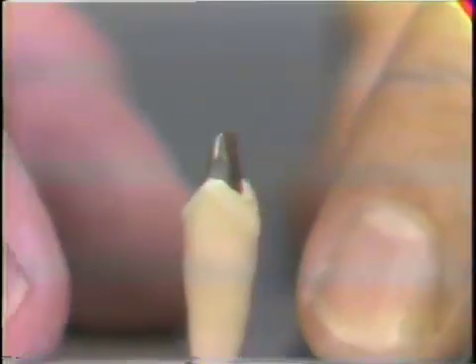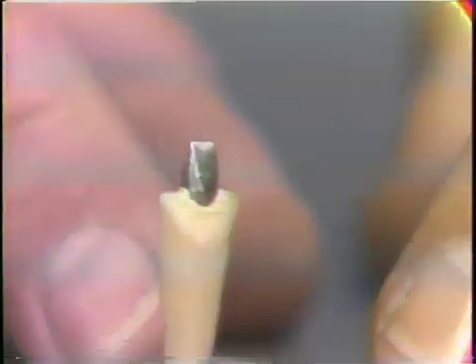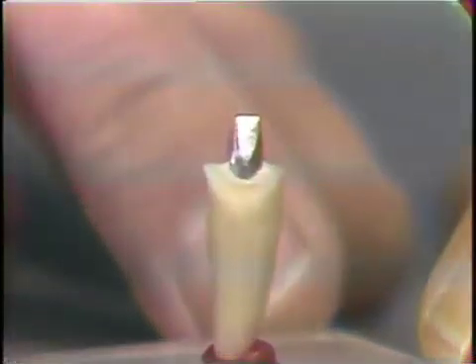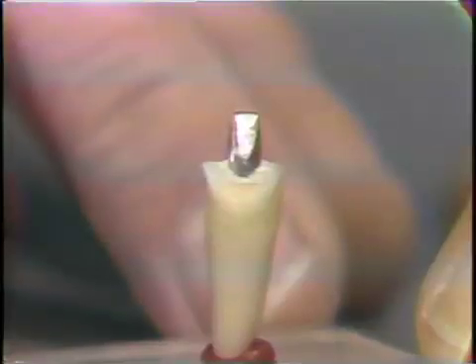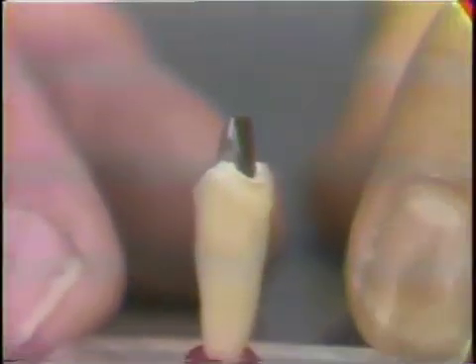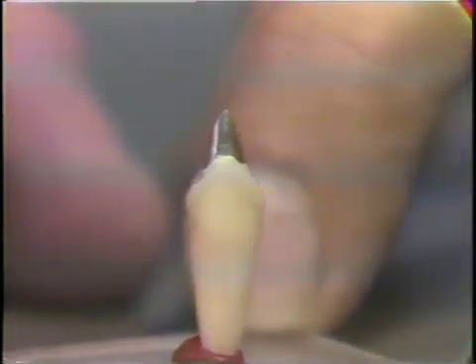root canal. This post, and this particular one, is a Charlton post. It's a prefabricated one which comes in a number of sizes and is fitted and adapted to the tooth in question, and the core part that you see is cut to the particular shape of a veneer crown preparation.